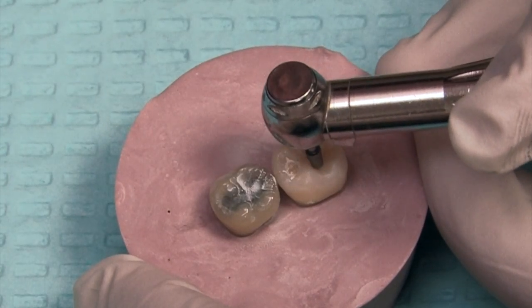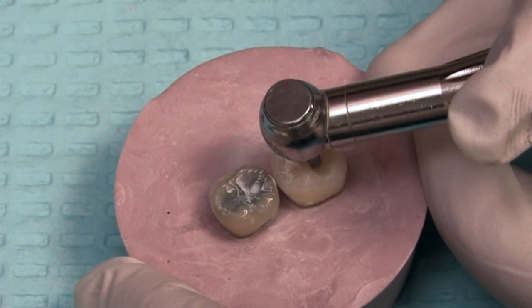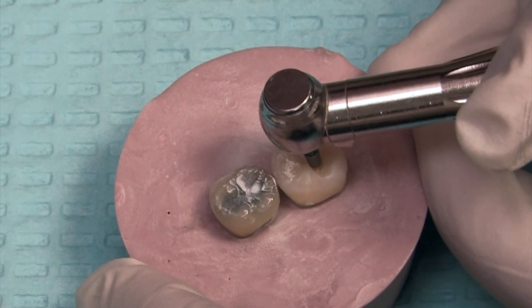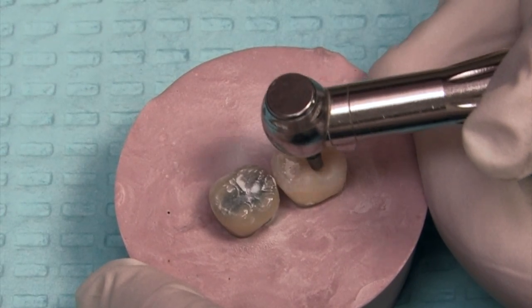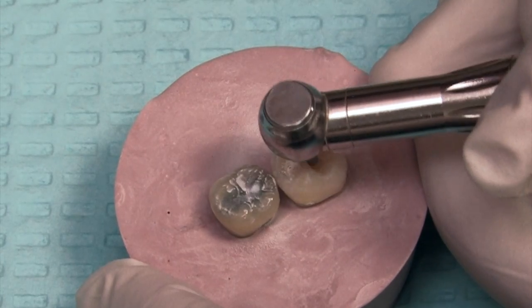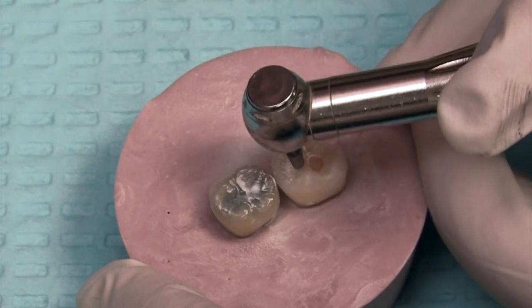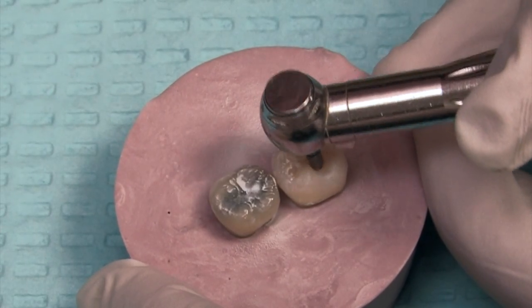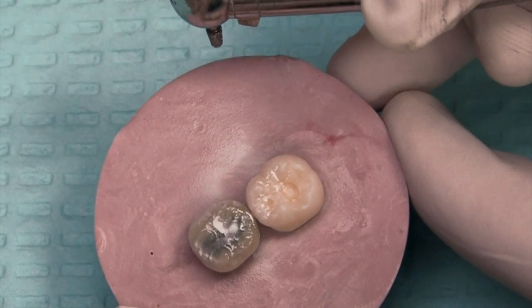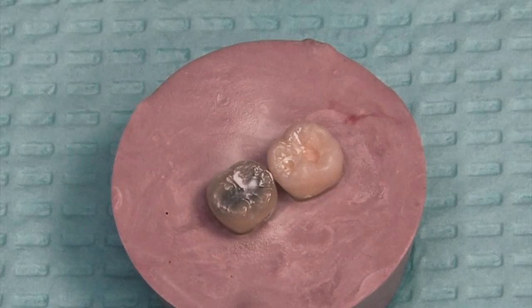I'm just going to work on doing these two cavity preps with kind of a brushing motion, going back and forth buccal-lingual, just trying to remove the decay without a lot of downward pressure. I've found that even if a patient is very numb, pushing hard apically, they can feel it. I like to use diamond burs instead of carbide burs, because under magnification, I can tell that carbide burs can cause micro cracks or craze lines within the enamel.